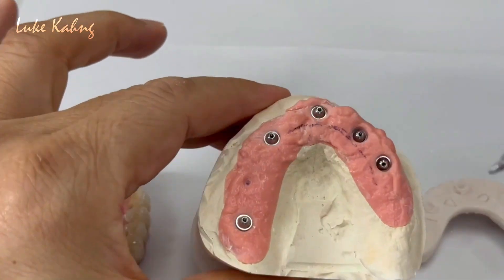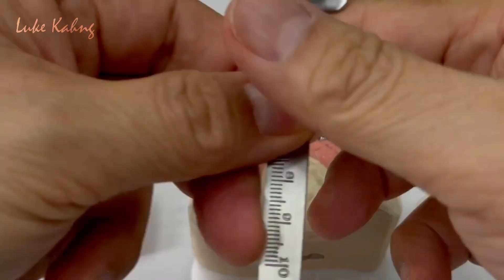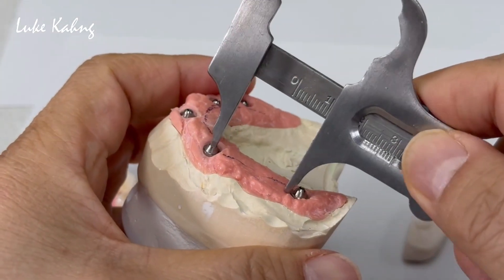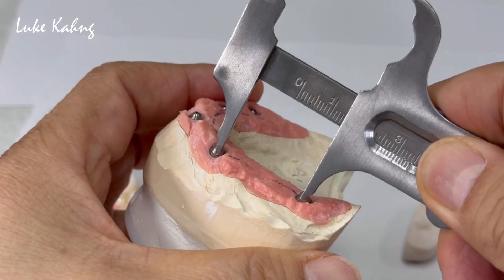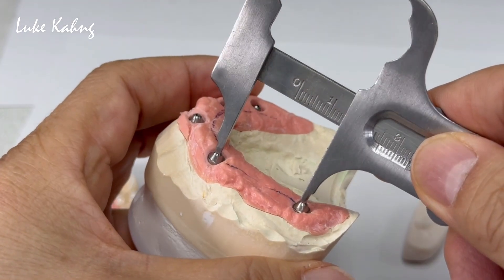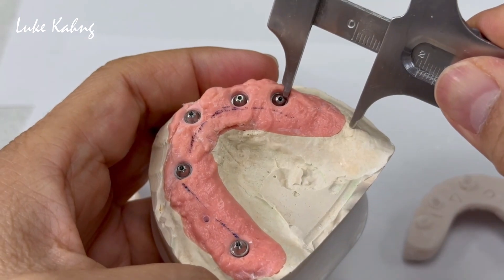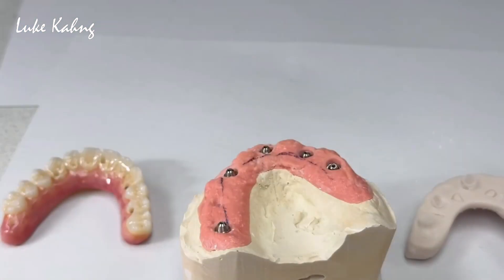This one is better because this long-span bridge has a huge gap. It's not possible — you can make the restoration, but it's going to break. The huge pontic is the issue, and here there is a little bit more problem too. So two evaluated areas, and then problems.